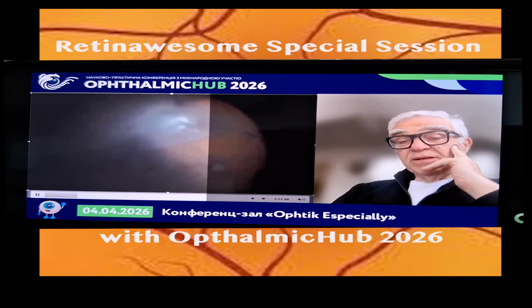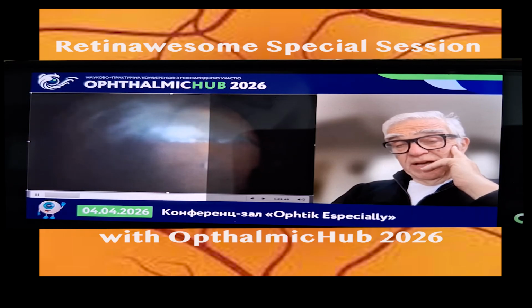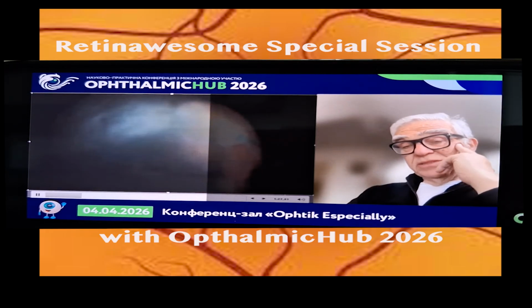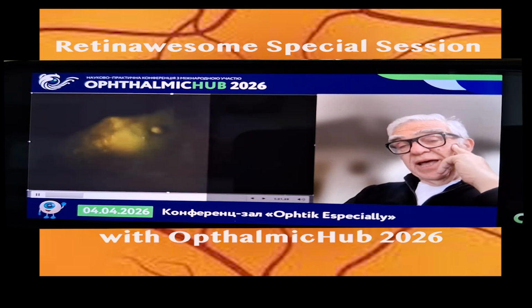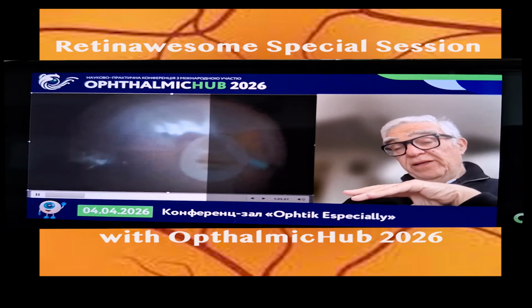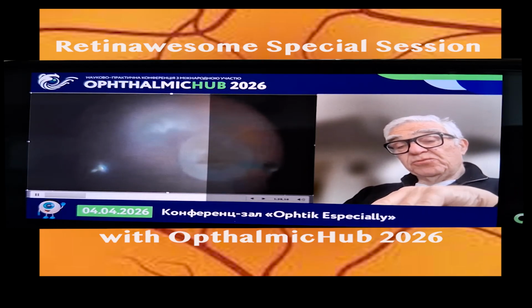And you can see the birth of the nucleus coming through the tear in the middle of the eye. Look how huge the nucleus is and how small the tear was. And we explain that by saying that it started the vitrectomy in the middle and then it dropped.